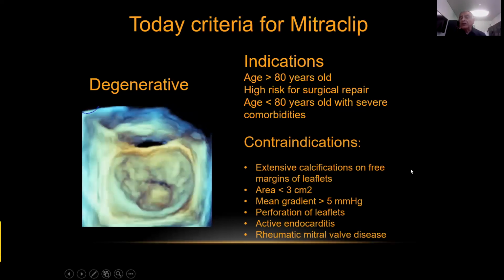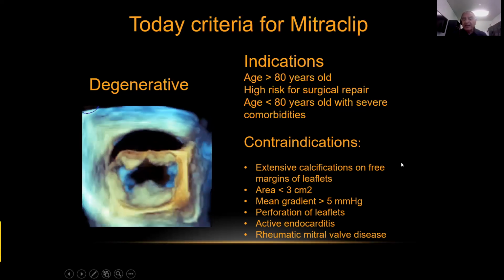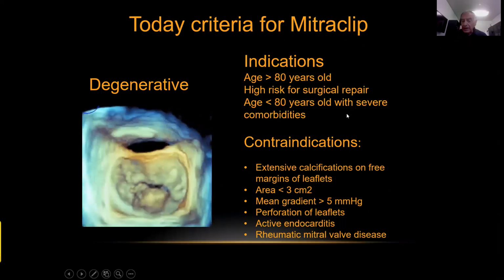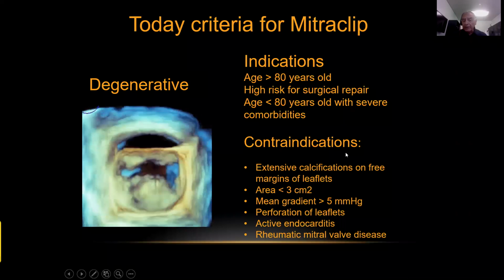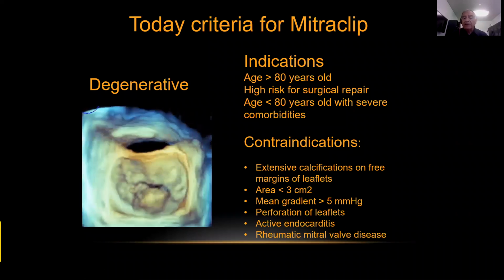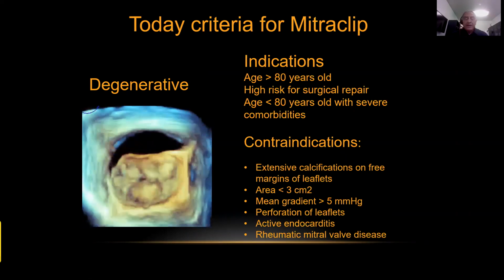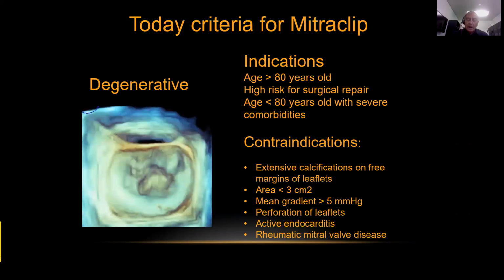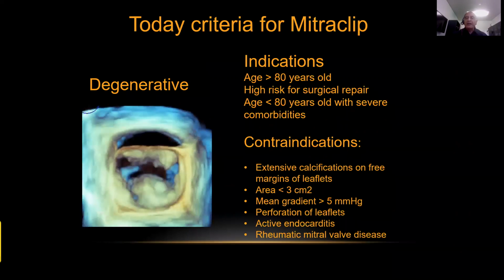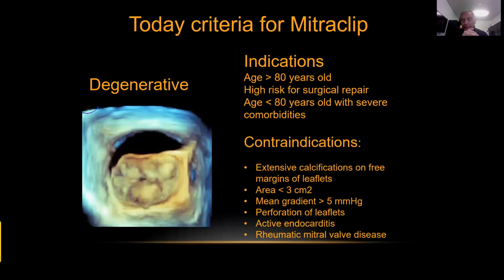But there are also contraindications, and we are very strict about that. Extensive calcifications on the free margin of the leaflets is one of the most important contraindications. A mitral valve area less than 3 square centimeters or a mean gradient more than 5 millimeters of mercury. We are well aware that these two numbers mean that after one clip, the stenosis may become intolerable for the patient.